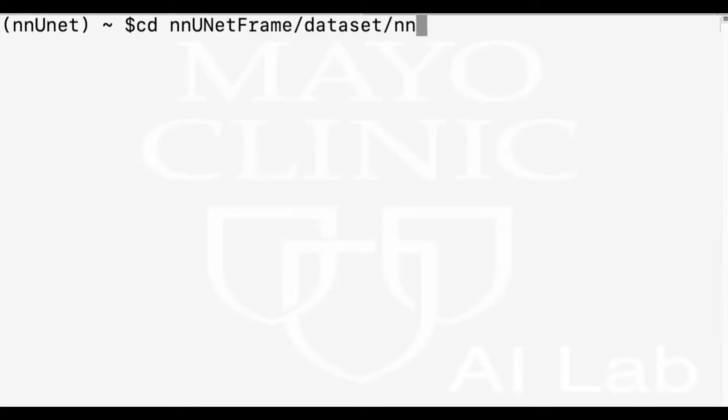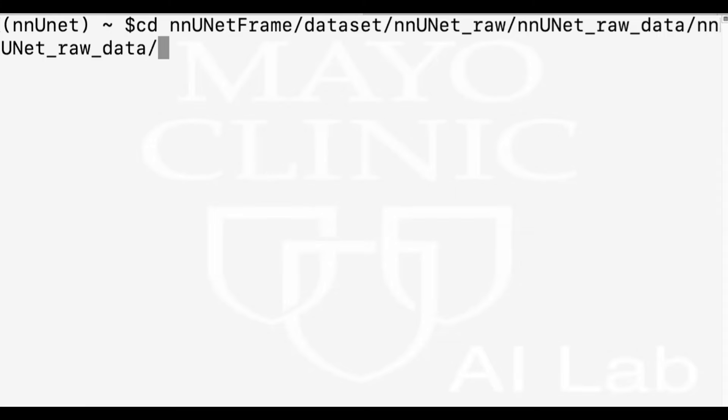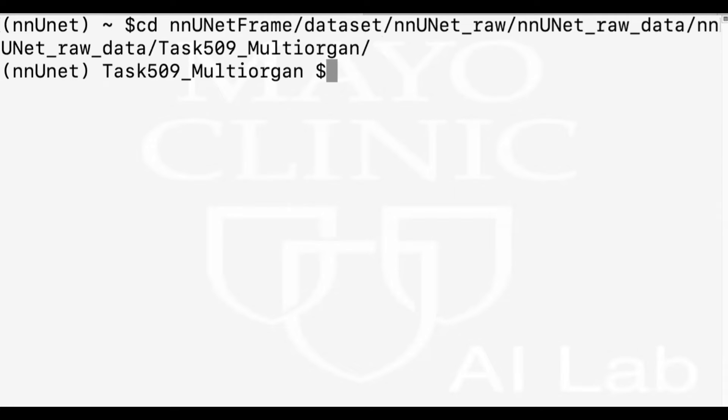Okay, let's go and follow these three steps. So first, I'll open my terminal. And please do not forget, for nnU-Net before doing anything, activate your virtual environment. And I'm going to create a folder in my task that I have trained. So I choose task 509 multi-organ. I'm going to make a folder with pred_nnUNet. And I'll create this folder for outputs and prediction results.